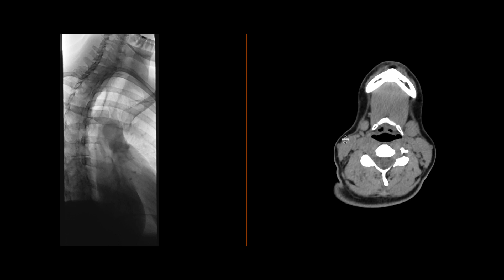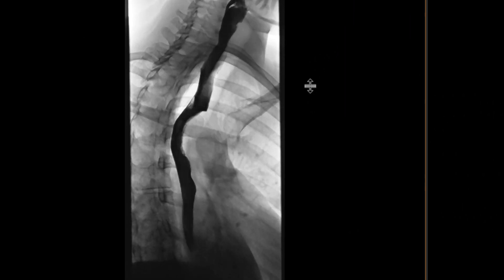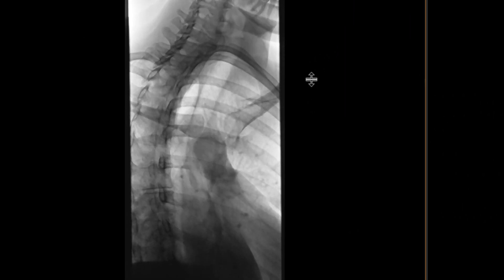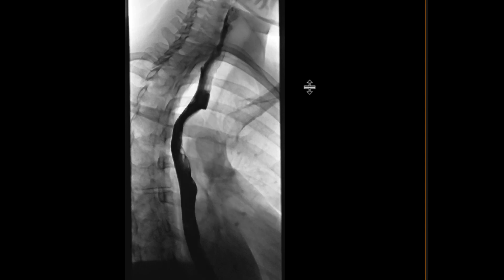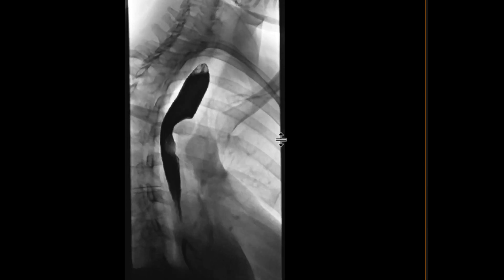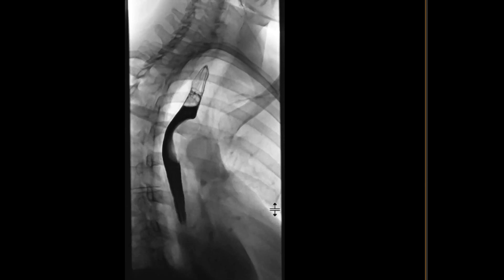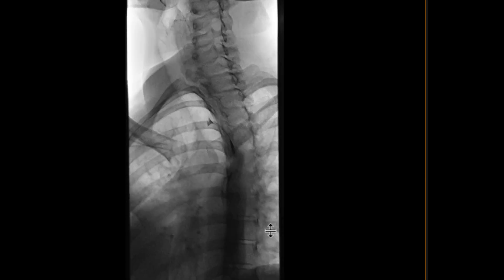This is a patient who came in with some dysphagia who got an esophagram. When you look at the esophagram, you can see almost immediately around the proximal to mid-esophagus, there's this indentation that's not a normal indentation. It looks like it's due to something that's presumably external to the esophagus or potentially within the wall itself.